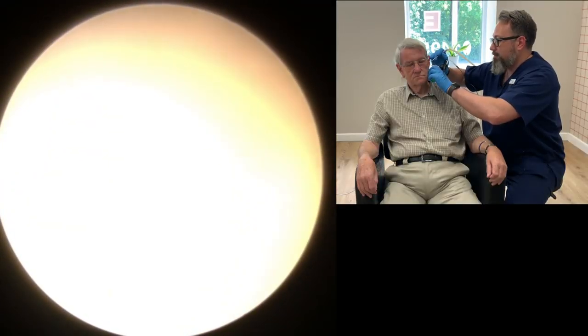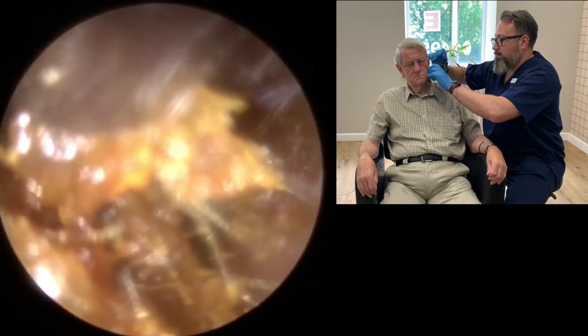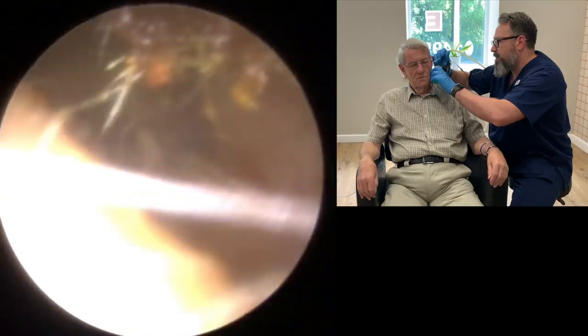So back in again now, where we took that large section, we had to clear that away from the tube. So we've got this bigger piece now traveling down the canal. There we go, out he comes. It's breaking away pieces at the moment. Is that good? Yeah, it's coming away nicely. We're down to the last bit, there's a little bit deeper in, that's the bit I'm leaning for next, okay?